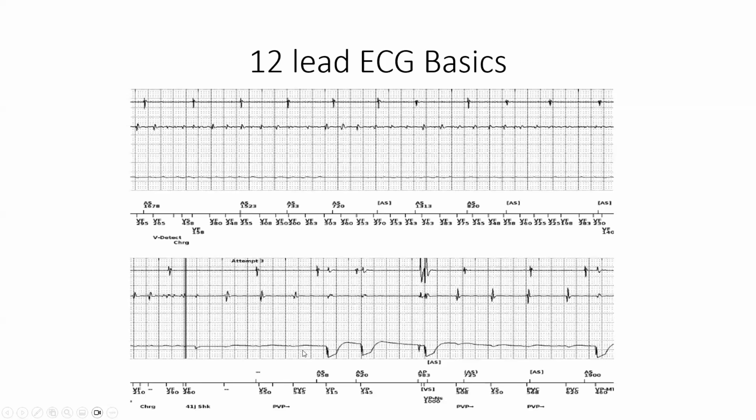So for patients that you see who have defibrillators, and it's obviously not converting them out of it, there is no harm in externally defibrillating these patients.